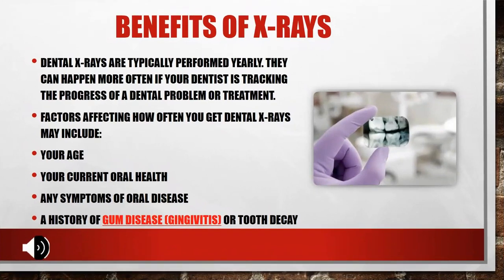As we understand what radiographs are, we look at some of the benefits of radiographs. It's important for children to have radiographs as early as possible because this can often help us identify potential dental problems, which will then prevent a more invasive treatment at a later age. So the factors affecting how often you get a dental x-ray may include the age of the patient, your current oral health, any symptoms of oral disease, and a history of gum disease, known as gingivitis or periodontal disease.